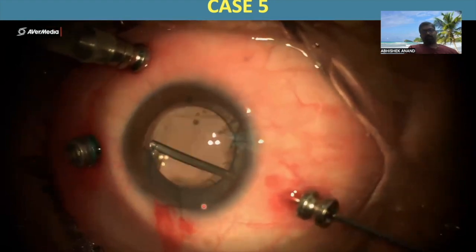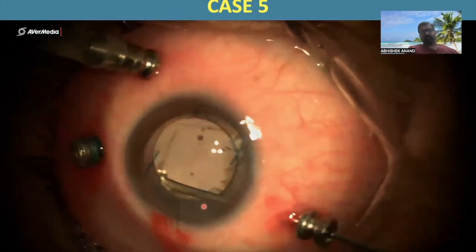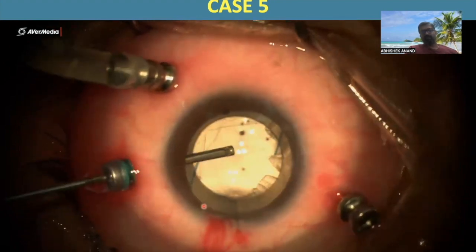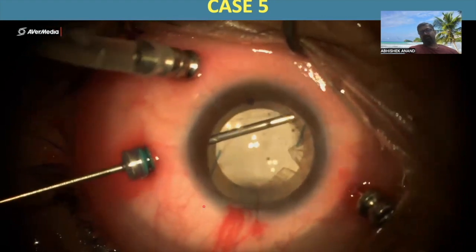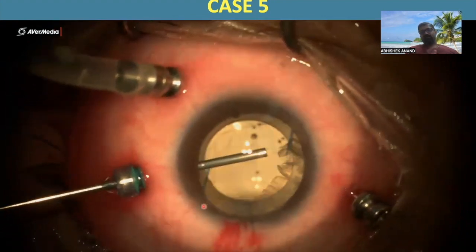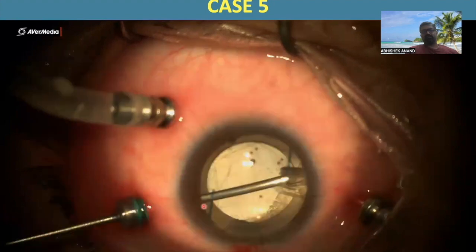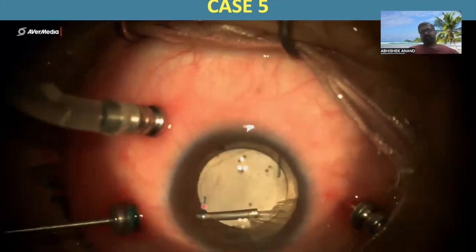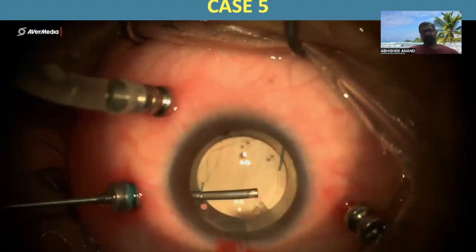Now this helps in a beautiful removal of the cortical matter without any undue traction to the vitreous fibers. And why is it so? Because whenever the cortical matter is aspirated, we cut it, and this ensures effective cutting of any entangled vitreous fibers.